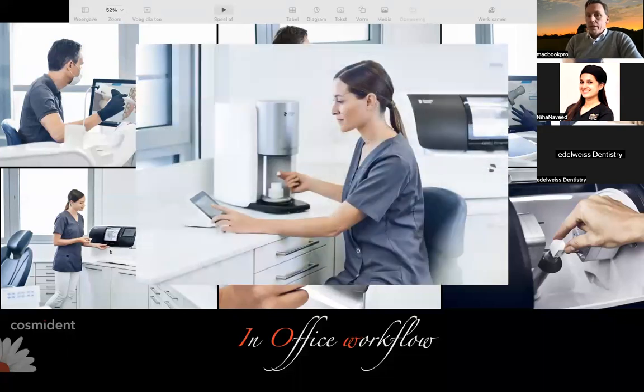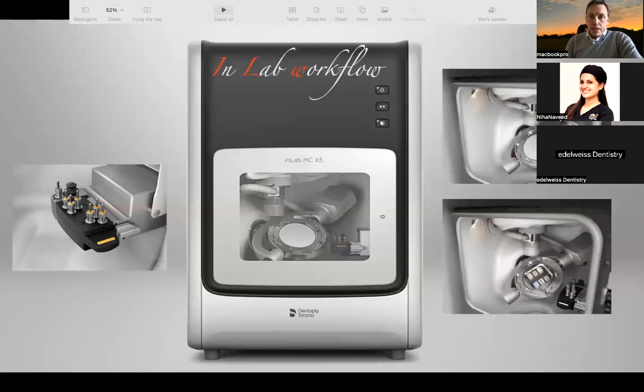That's a little bit the idea of how we work. We have two workflows: the office workflow and the in-lab workflow. Like I told you, we have our own lab. The nice thing about having our own lab is that they can work for me and do all the work for the patients who are in the office immediately. Here you see some of the blocks in the big machines. We can mill six crowns or six restorations together in one session.